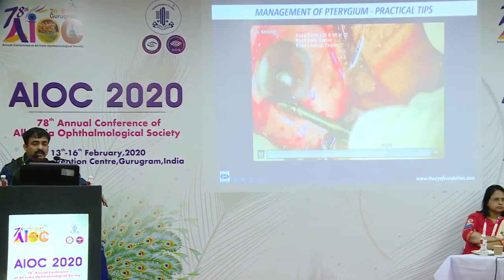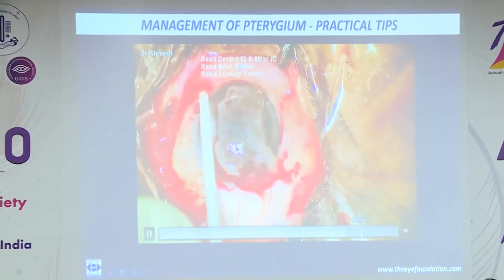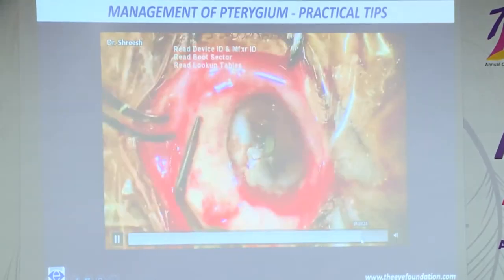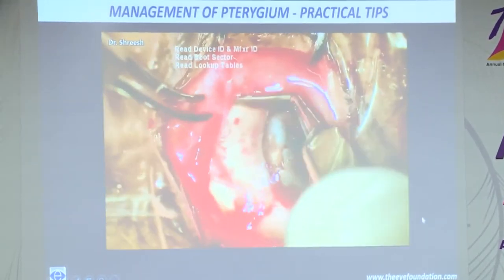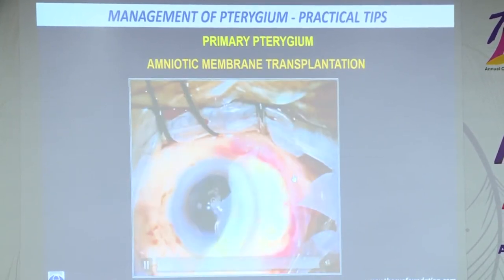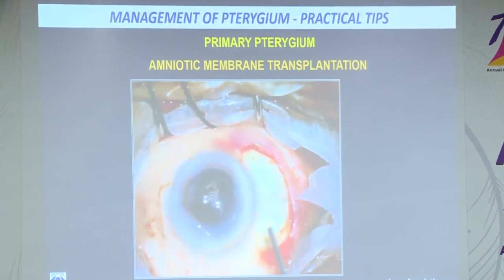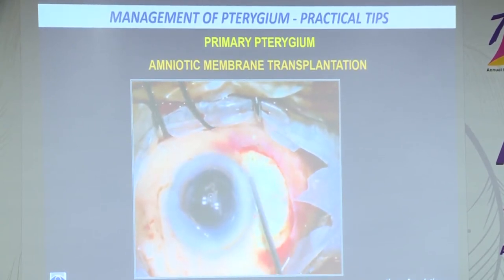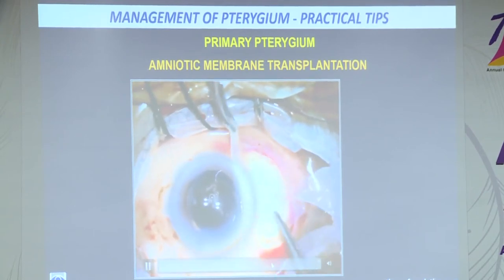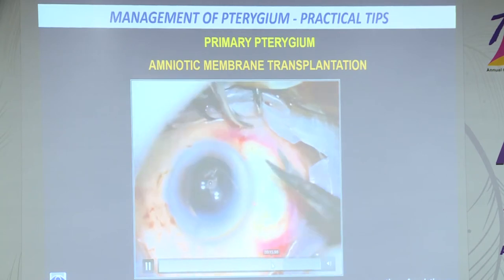Place it on the bare scleral bed. Either glue it or suture it. Amniotic membrane has been tried and many surgeons are using it for management of primary pterygium, and it's been found to be effective in the management of primary pterygium. It is as good as conjunctival autografting.